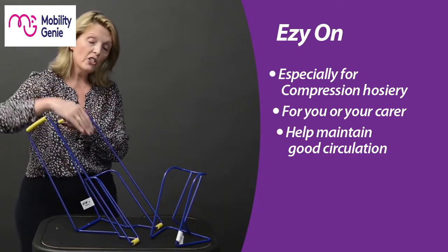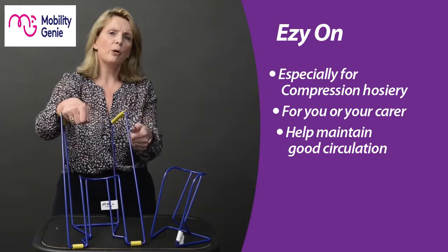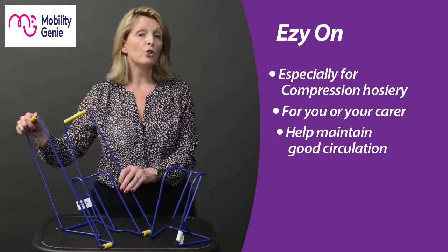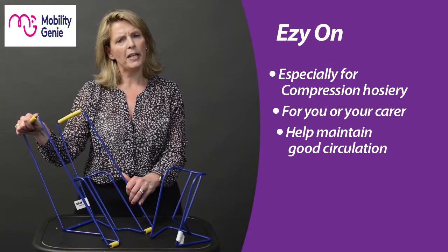At that point, put it onto the floor and gently angle it — as you can see the angles here — to slide the foot down, then work the frame up the leg. Once we get to the knee, you can generally pull it up and manage from there. The Easy On small and tall are designed specifically for using compression hose, to help build compliance and maintain healthy circulation.